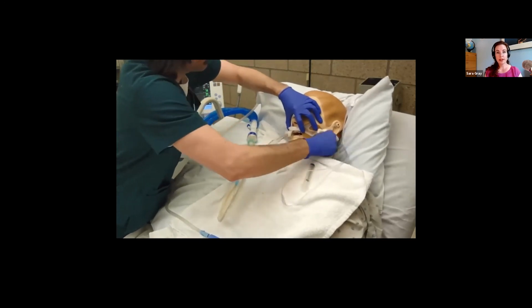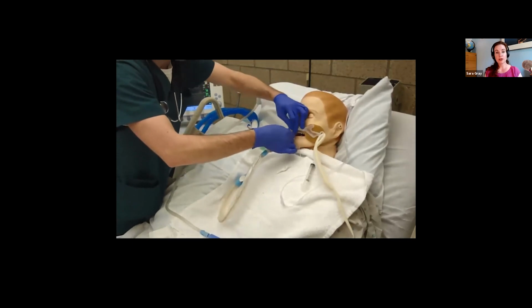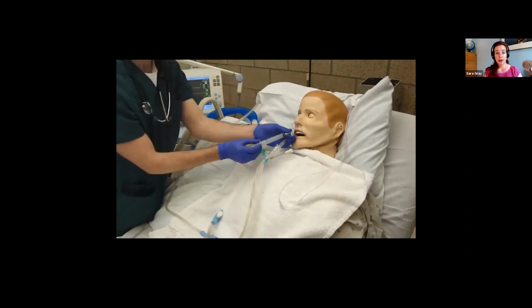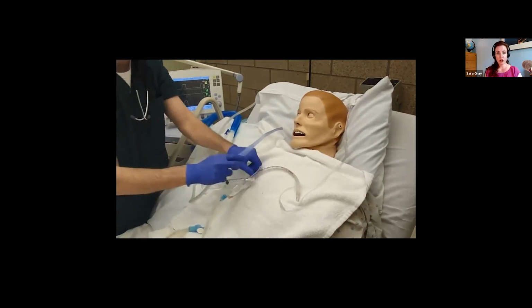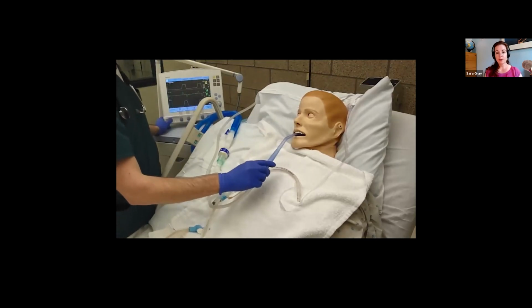You then are releasing any trach ties or whatever is securing the tube, and you attach your 10 cc syringe to the balloon. When your patient's ready, you coach them to take a deep breath in. When they're holding their breath, you deflate, pull it out. Encourage them to cough while you suction out their mouth. Encourage them to take some deep breaths.